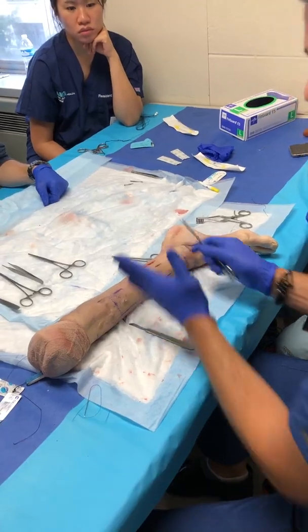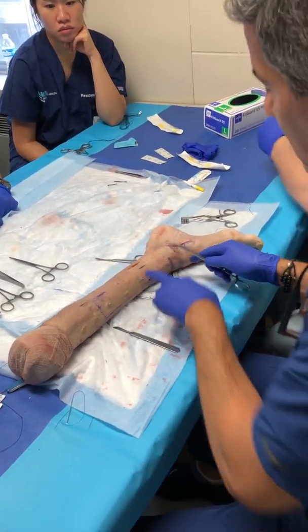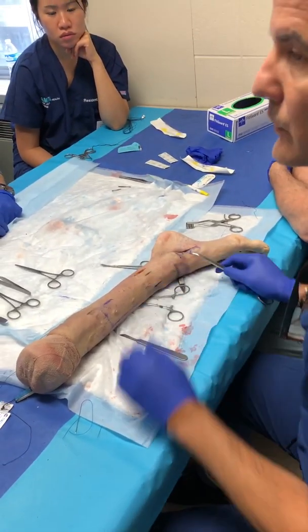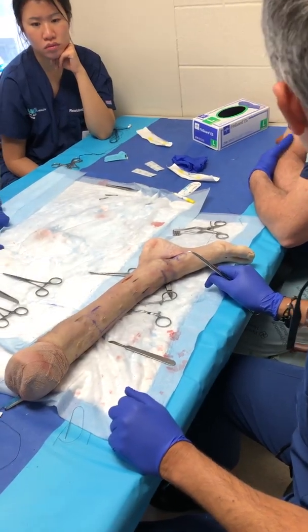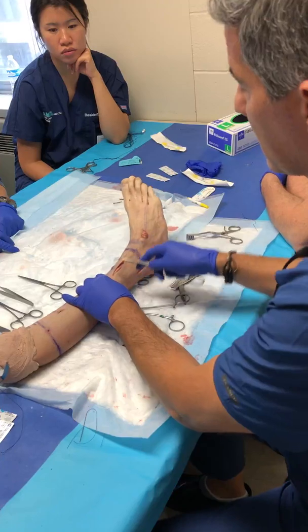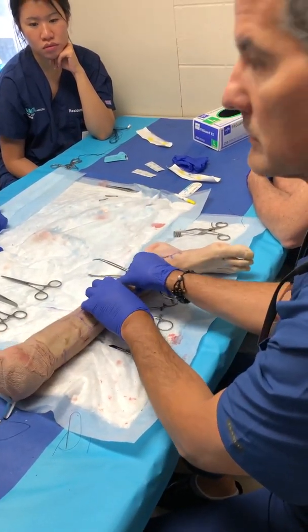Then, second incision will be at the distal 1/3 of the tibia. You palpate the medial border of the tibia, a centimeter, and you're gonna make a 4 centimeter incision at that level. At the same level on the anterior compartment from the tibial crest 1.5, same size.